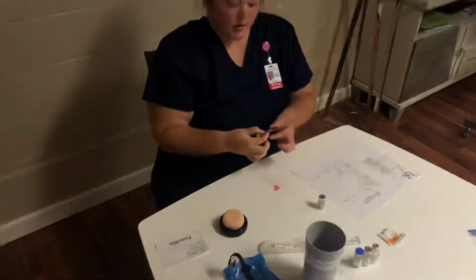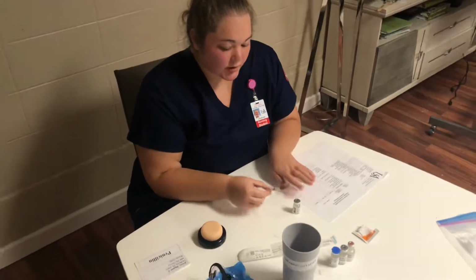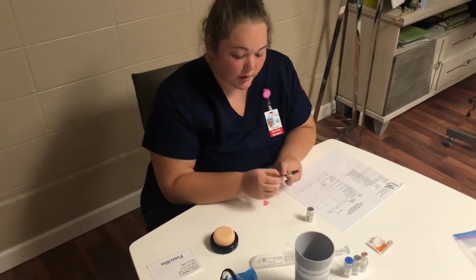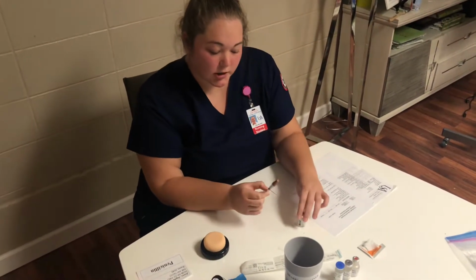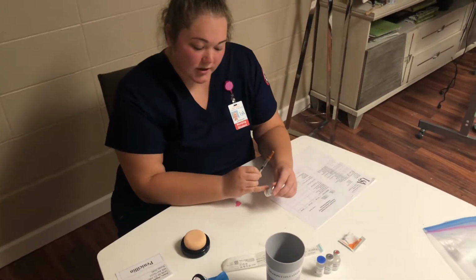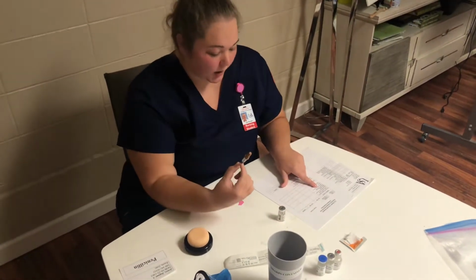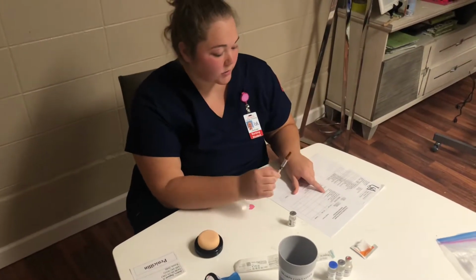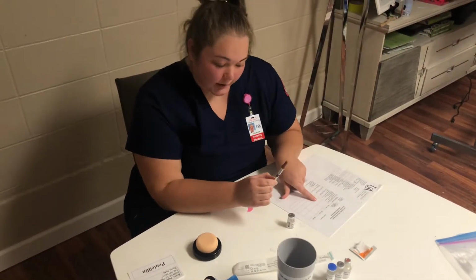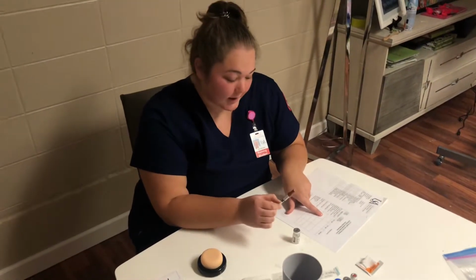Okay, so now I'm going to check that the medication I've drawn up matches the MAR. So this is 0.5 milliliters of heparin in a tuberculin subcutaneous syringe. This is heparin 10,000 units per milliliter. So Mr. Jones needs 5,000 units. That's why we've got 0.5 milliliters subcutaneous syringe every 12 hours. He has not yet received it today, and he is going to be getting this injection at 8 a.m.